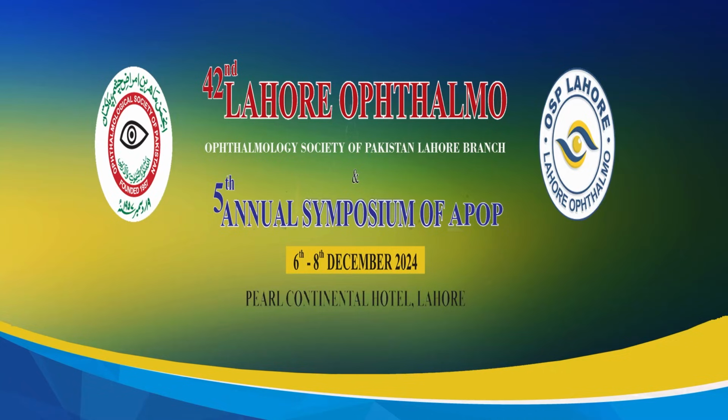अच्छा, दूसरा बहुत इंपॉर्टेंट डिस्कशन जो हो रहा है इसमें लेज़र. I do very aggressive laser, you know, to the point of white spots. This is your only and the best chance to treat this aggressive disease. And the more laser you apply, the more the chances of a successful surgery. Seriously, I do as much laser as I can. Peripheral, posterior, everything. Obviously, outside the arcades. And believe me, you have to be very generous in putting stronger laser burns.